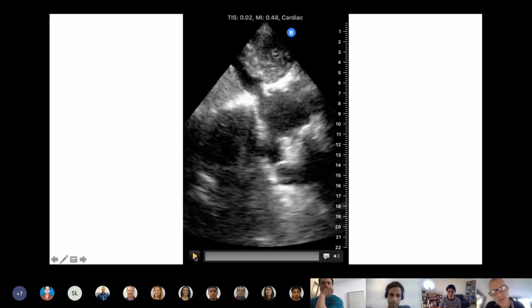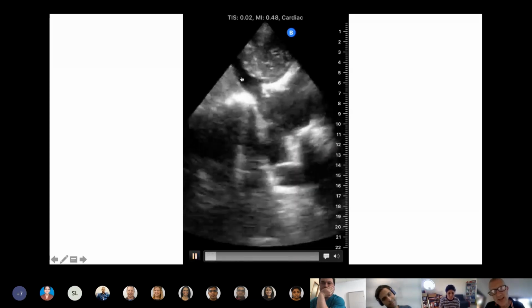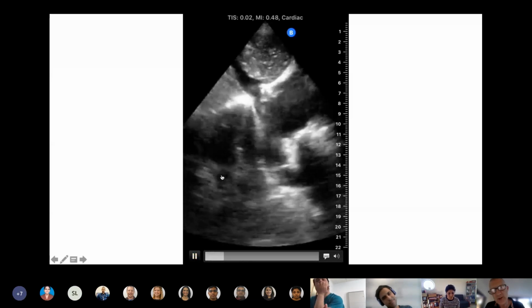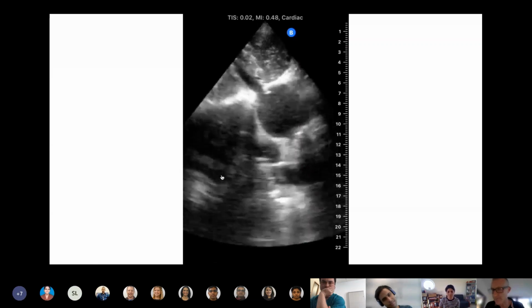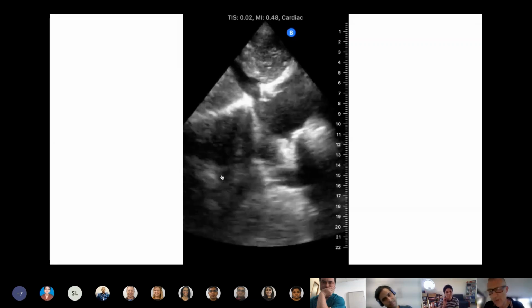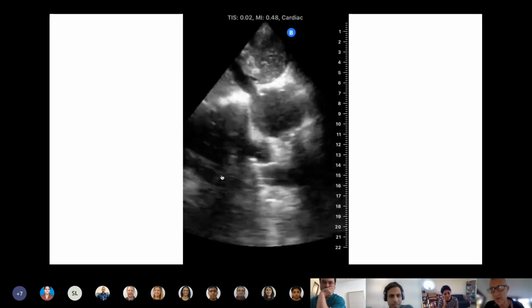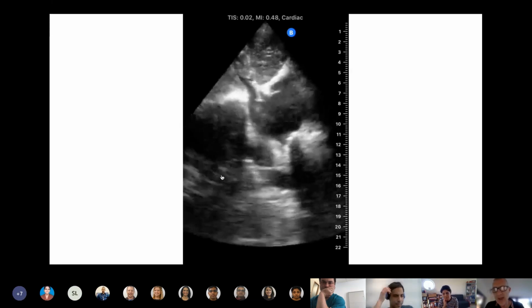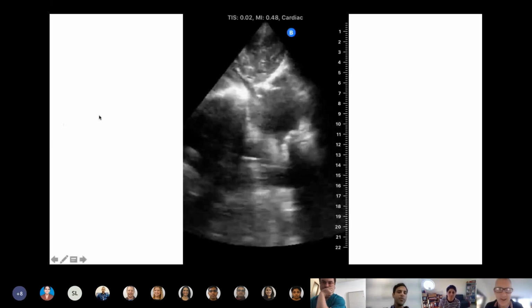And this is an inferior vena cava. I want you to look at the top of the IVC here as it goes into the right atrium, and you'll see the impact that respiration has on the diameter of the inferior vena cava. As you can see, as she breathes in with respiration, the IVC becomes almost occluded. So she's so centrally dry, and of course the urea is clearly our big giveaway here, that actually there's plenty of room in this circulatory system for some IV fluid. So this is someone in whom we're clearly going to push fluid, not diuretics, as we would with heart failure AKI.